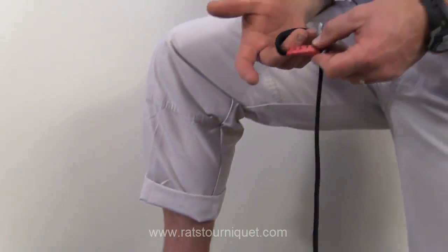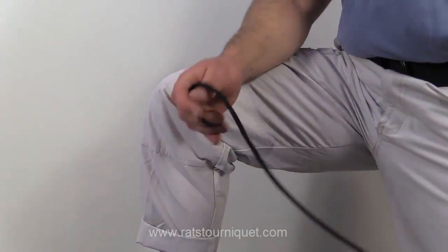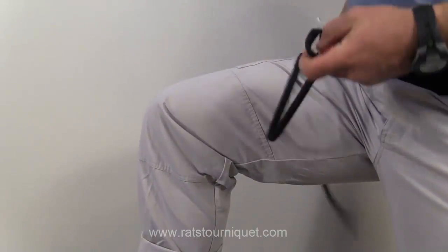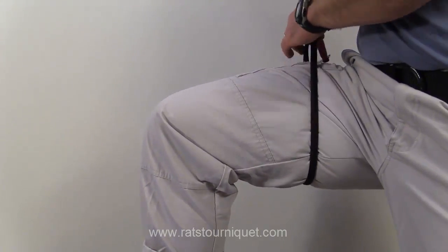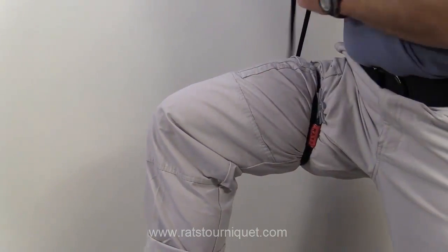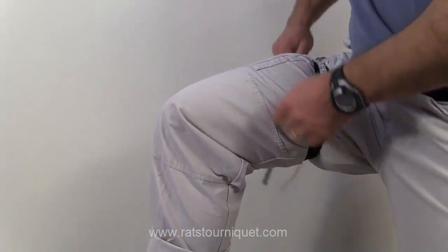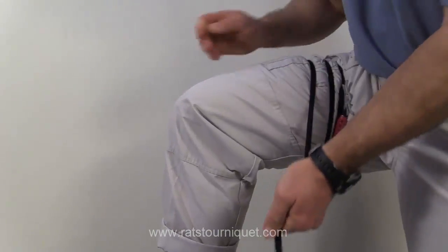With a RATS tourniquet we have our three finger loop, we have our cleat, and then we have the running end of the tourniquet itself. With a RATS, simply run it through the loop, pull down tight, and wrap so that the circumferential wraps create the amount of tissue compression that you need to shut down blood flow.